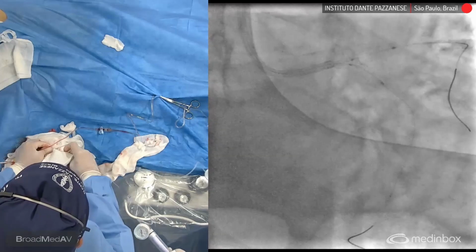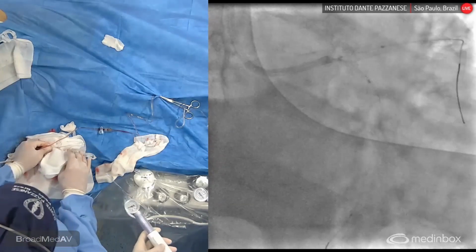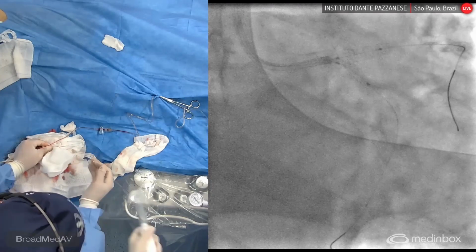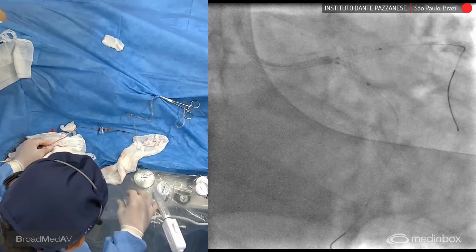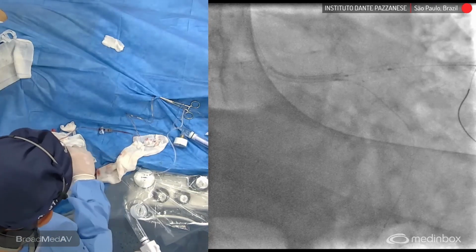So Ricardo here, you just had the angulation and you needed to do that. So can we go up here, Rodolfo? Yeah. Okay, so we're gonna go just to fully open, higher pressure. And then I believe you're gonna go with the 3.5, right? To post dilate. Balloon 3.5 by 12 post, please.